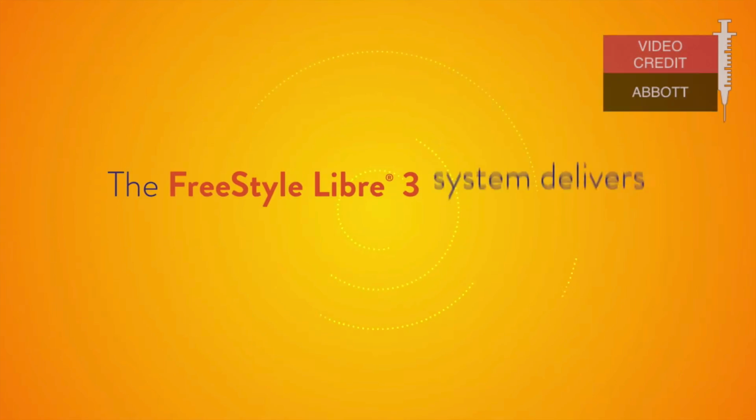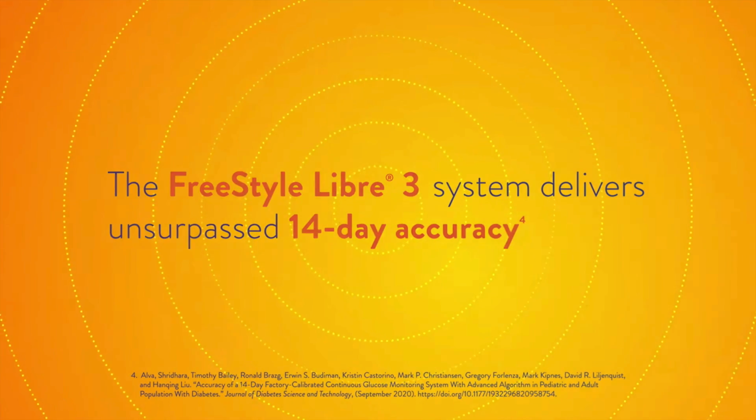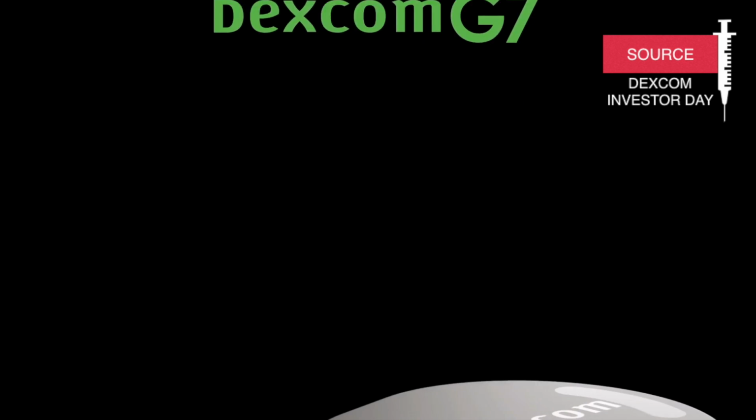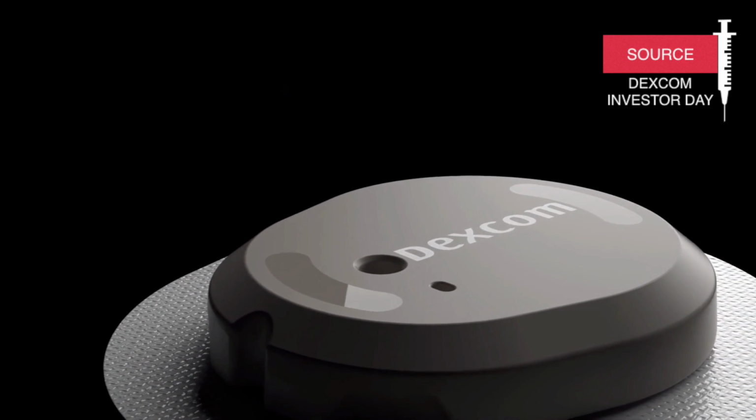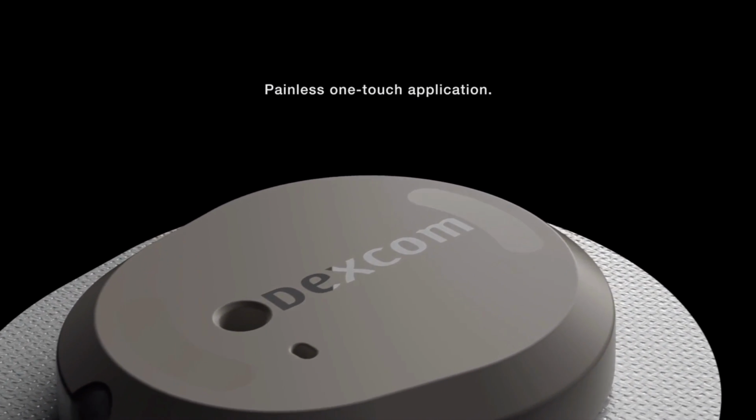When it comes to wear time, the FreeStyle Libre 3 will work for 14 days, so no change to the previous version. The G7 wear time at launch will be 10 days, and this is a bit disappointing because Dexcom has been talking about extending the wear time beyond 10 days. They say that clinical studies show consistent performance over a period of 16 days, but the 16-day wear time was not part of the initial clinical trial.